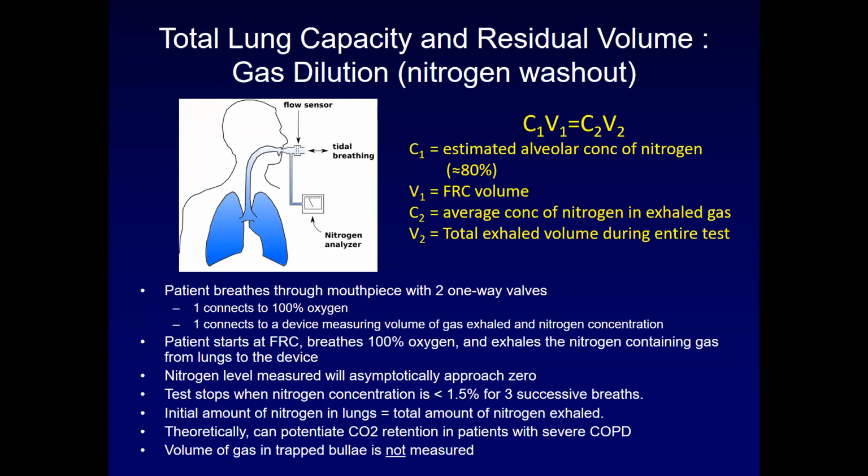The problem with this test is theoretically it can potentiate carbon dioxide retention in individuals that have bad enough COPD. The other bad part of this test is that the volume of gas that's in a trapped bulla or unaerated part of the lung is not measured at all.